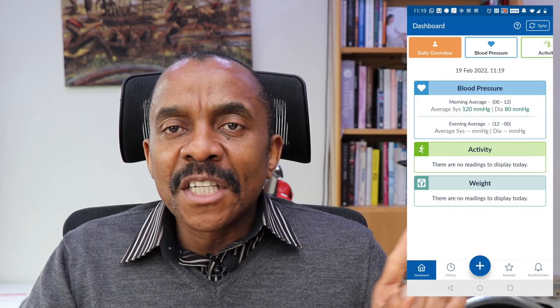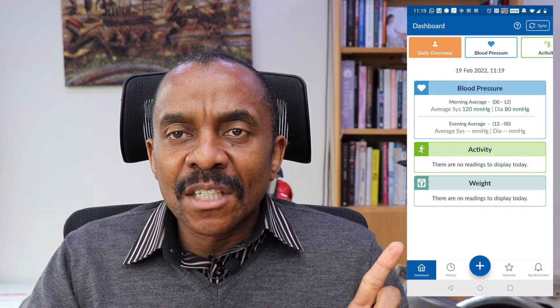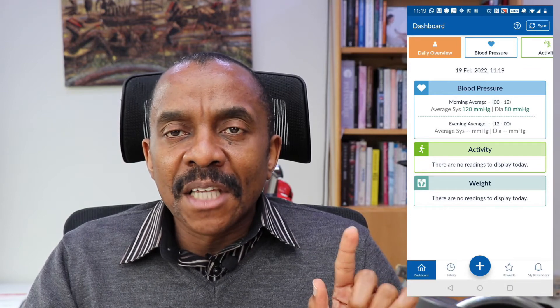When you open up the app, it gives you a summary of your daily activity — this is the first interface you see. It tells you what your blood pressure reading is for the day; if you took three readings, it would display the average. There is also an activity feature and a weight feature, where you can set goals for steps and body weight, though I don't use those as I have a Fitbit.